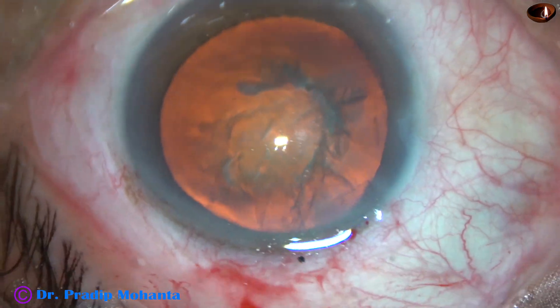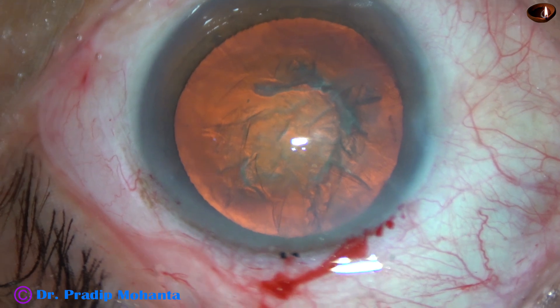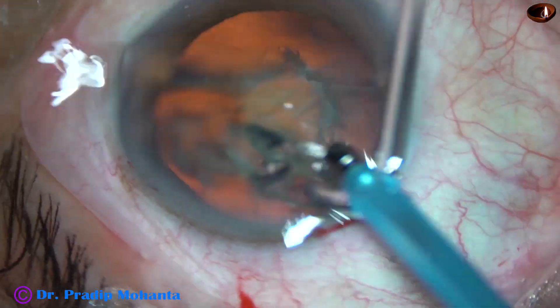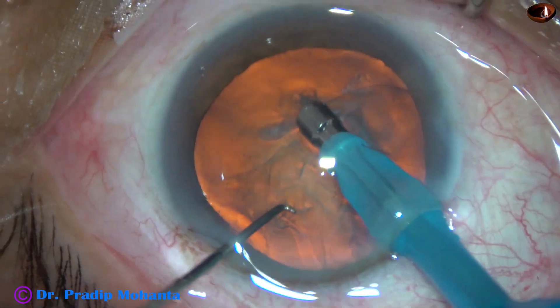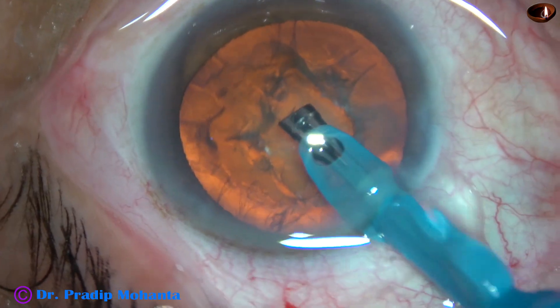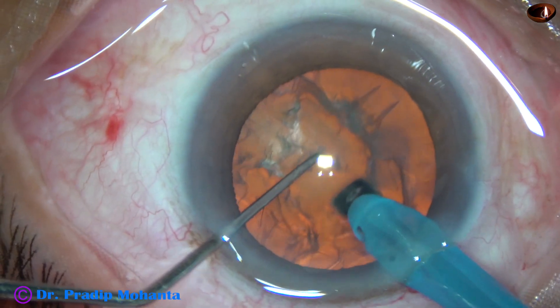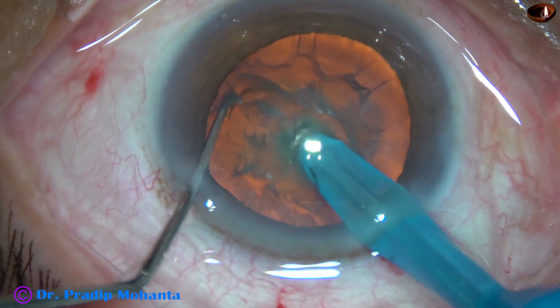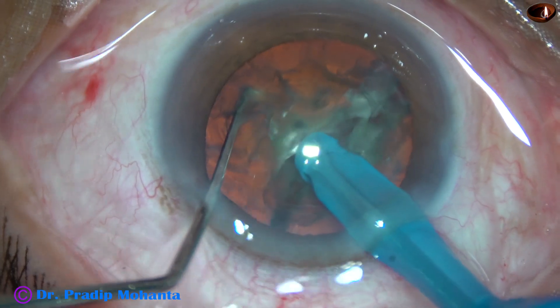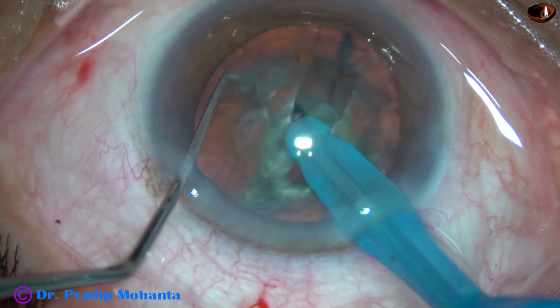Now, what is the hardness of the nucleus? Because of the red glow, the cataract is appearing soft — but it is not. The red glow may be deceptive and we may misjudge the hardness of the nucleus. After aspirating some superficial cortical lens matter, the handpiece is turned to make the bevel up. The tip is buried into the substance of the nucleus just in front of the main incision, goes through the nucleus towards the opposite equator, and it is chopped. We find that this cataract is quite hard — it is not a soft cataract. So, red glow may be deceptive.